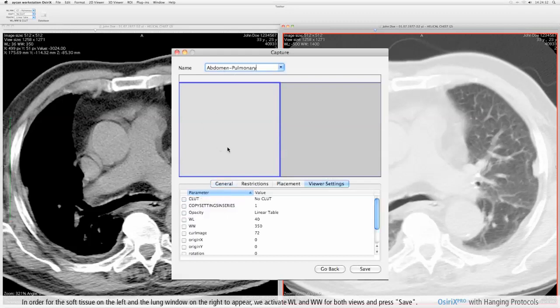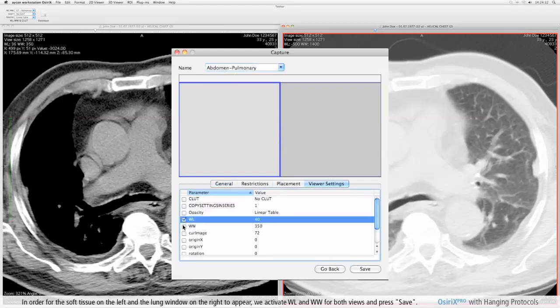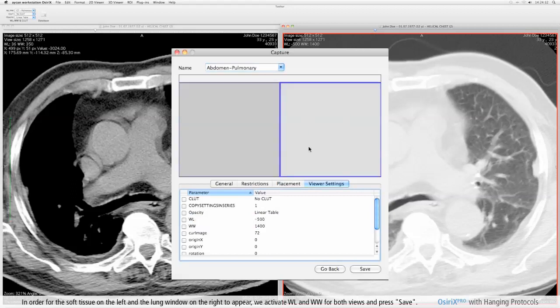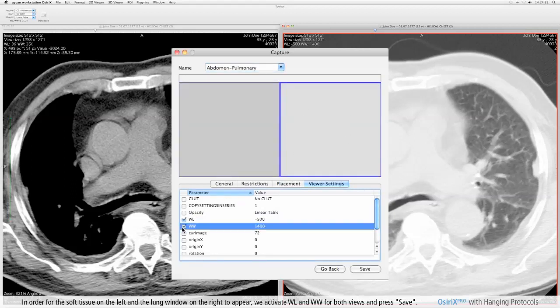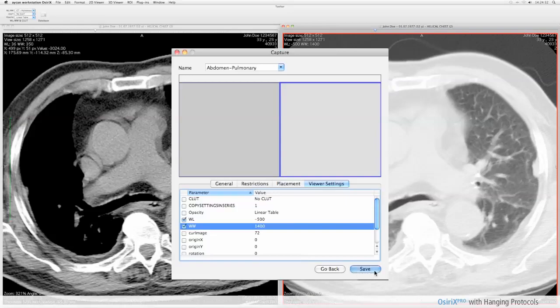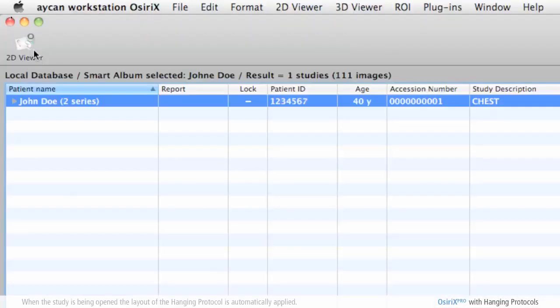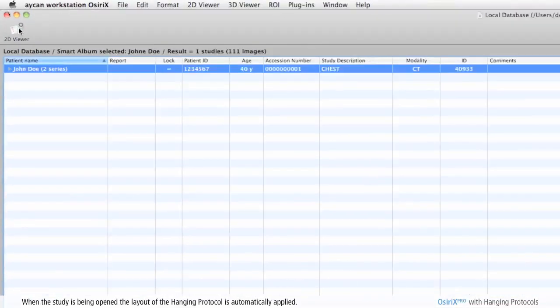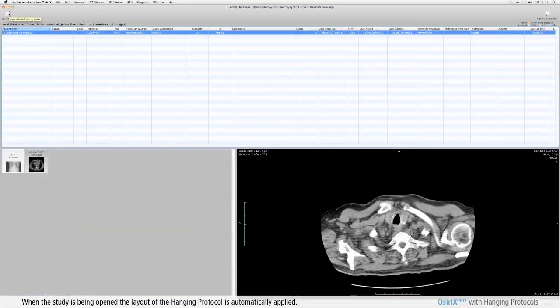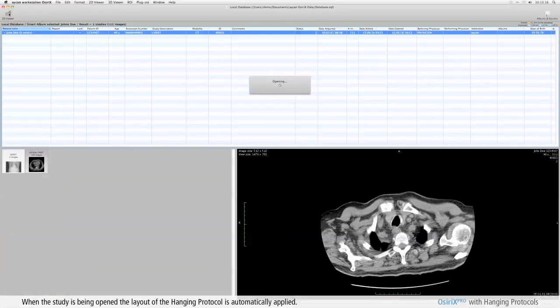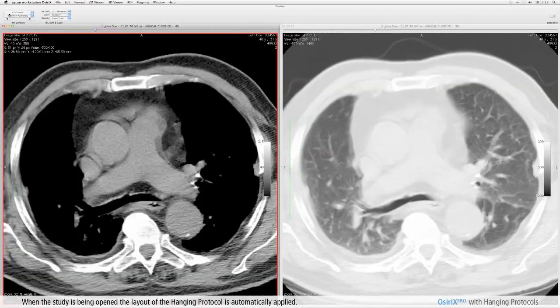In order for the soft tissue on the left and the lung window on the right to appear, we activate WL and WW for both views and press save. When the study is being opened the layout of the hanging protocol is automatically applied.